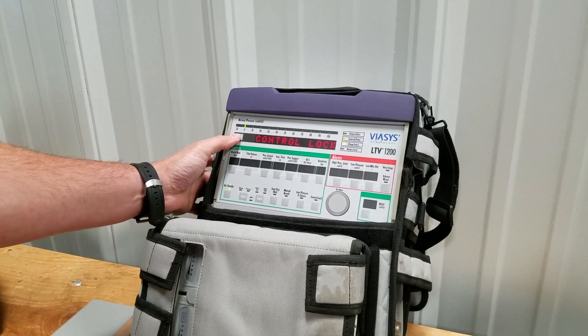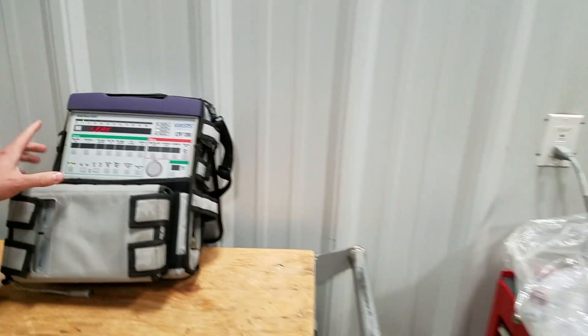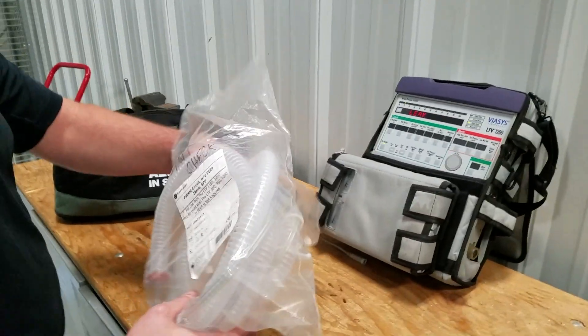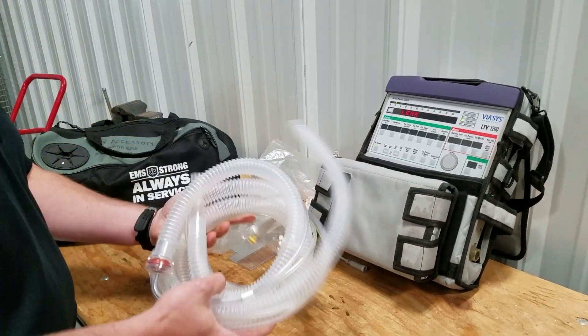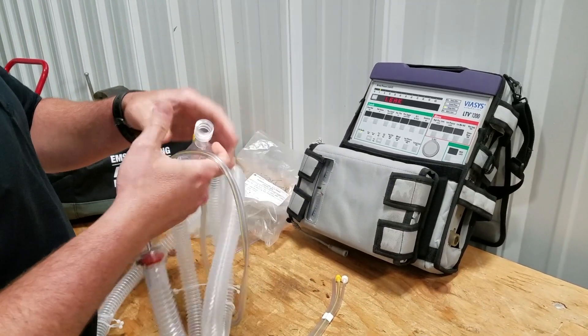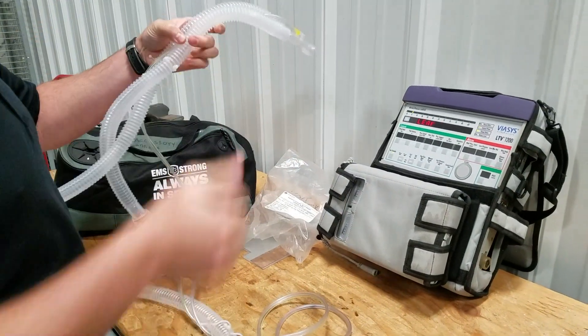Once that all passes, we're going to press select again and it's going to go to the leak test. For the leak test we're going to need our vent check tubing — keep that right next to the vent. We have our patient end and the end that goes to the vent itself.